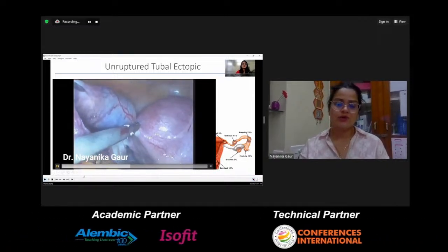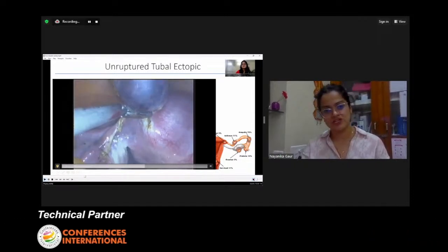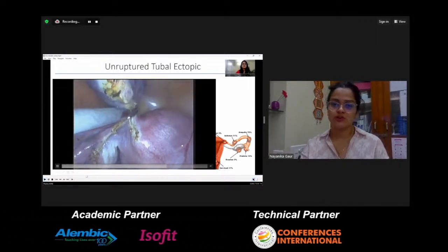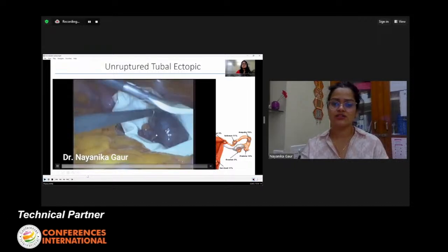In these patients, salpingostomy can be done, however, I prefer salpingectomy over salpingostomy. It's a clean procedure. The tissue was very comfortably removed in an endo bag made from a glove and removed through the 10 mm port.